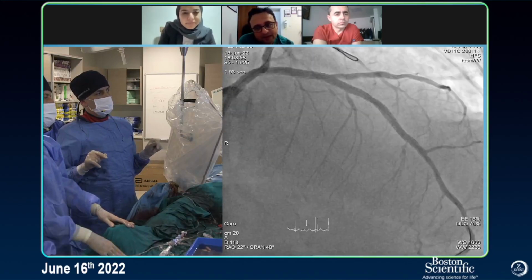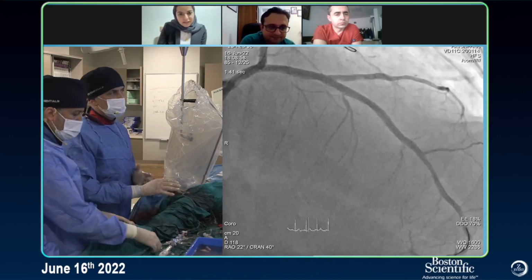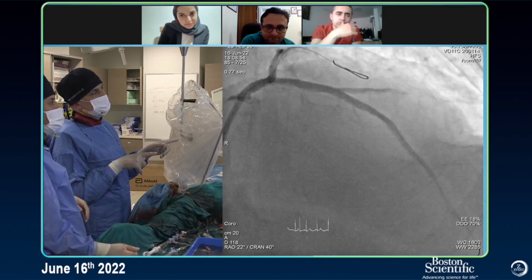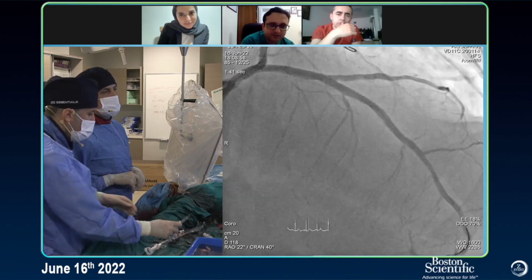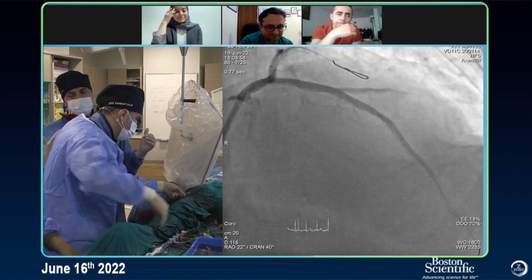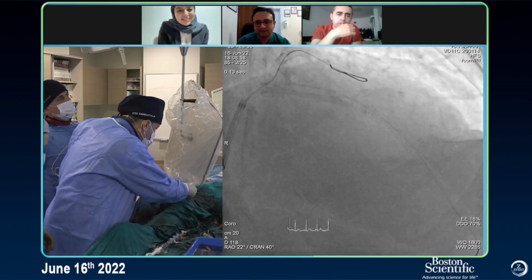Yeah, I agree. We've done enough. No, we will have rupture for sure here, I'm sure. I think tracing it, I'm pretty sure you'll get an MSA more than 5.5. If I go with a bigger balloon, I easily have rupture. This looks pretty good, I guarantee you guys. And if I rupture and I have to put a graft, the risk of stenosis may be very high after two steps, 50% in 1 year with graft stents. So you're way better with this.